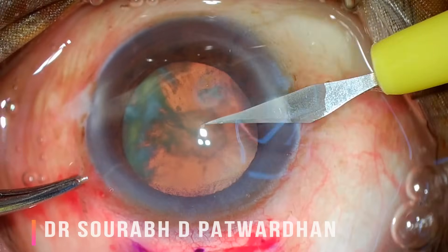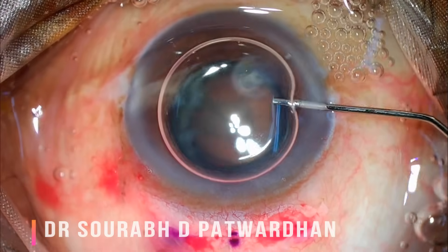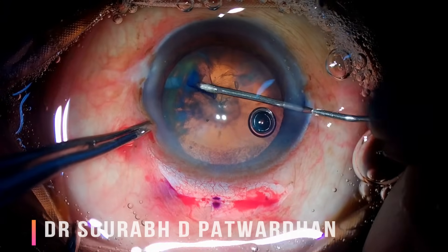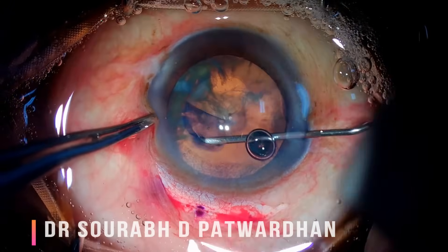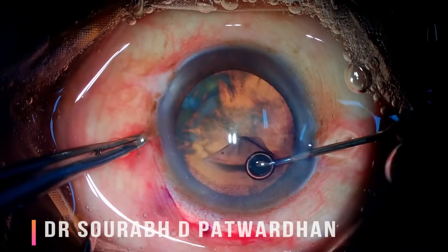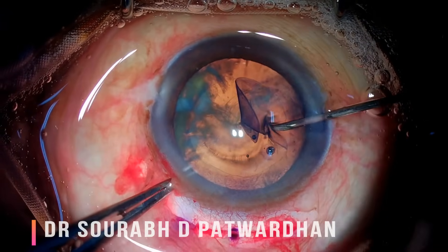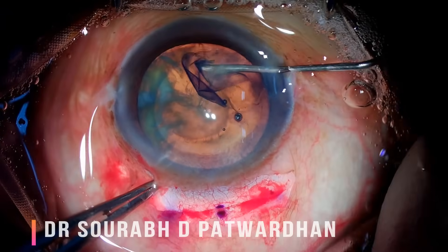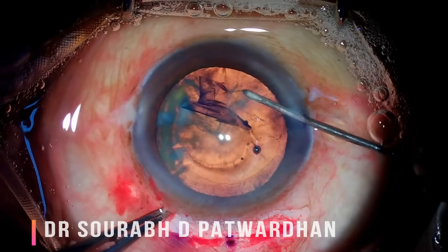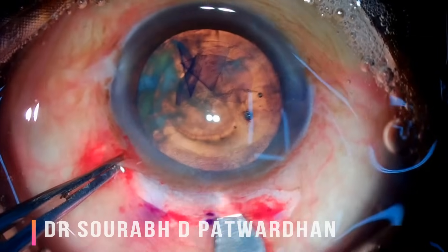Now I am making the side port incision, which has to be larger compared to what we use in PHACO, because it has to accommodate the Simcoe cannula which is commonly used with SICS. It is important that you make a good large rhexis. I already described the principles of making CCC using a cystitome in another video, and I am using the same method and steps here.